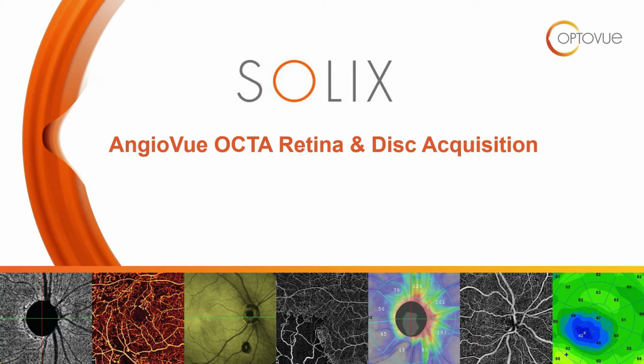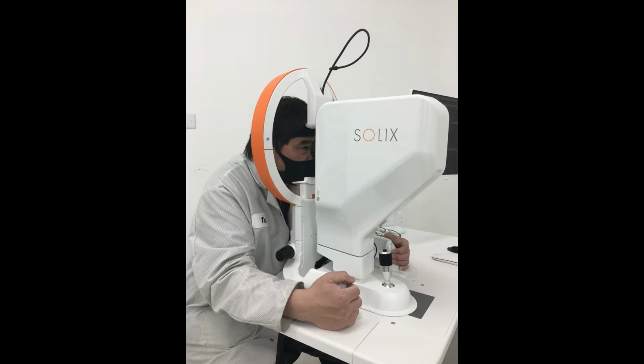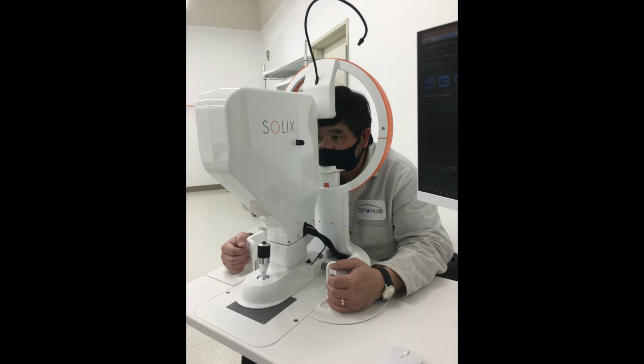Solix view acquisition. Position the patient by adjusting the table height so they're leaning slightly forward and gripping the handholds attached to the chin rest base. Make sure their teeth are together, their forehead is against the rest, and their eyes are level with the canthus marker. If you are right-handed, hold the joystick vertical and push the base with your left, and if you're left-handed, the opposite.